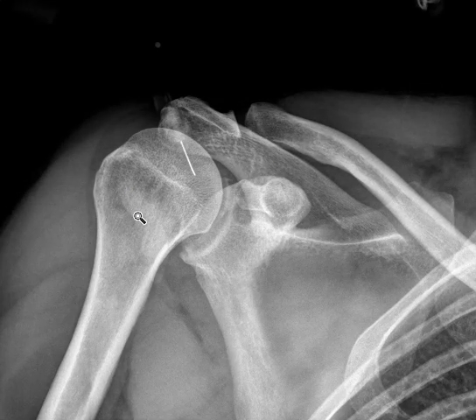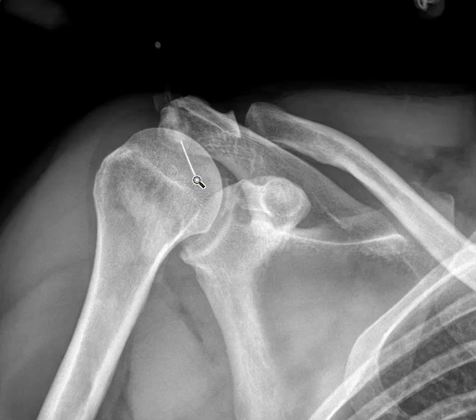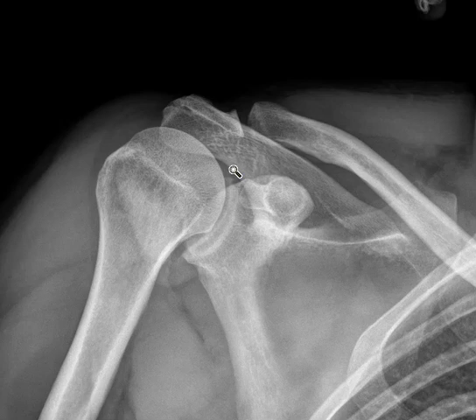When it's injected, we'll see the contrast down here or up into the joint. Sometimes we'll see contrast around the tip of the needle — that means we have not gone into the joint. We go straight down with the 25-gauge needle until we hit the bone, and then we know we're in the joint. On occasion it'll pull out a little bit and we'll see contrast going horizontally into the subscapularis muscle. Sometimes patients experience pain when we inject, or we'll see contrast pool around the tip of the needle. But when the contrast flows far away to the dependent portions of the joint — the low pressure areas — we know we're into the joint.